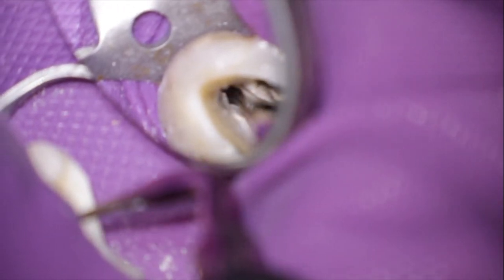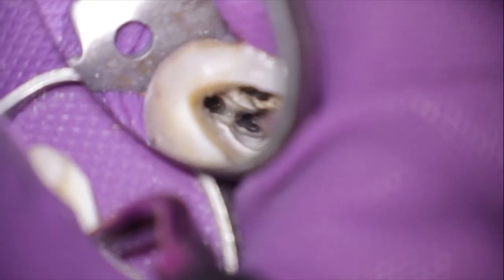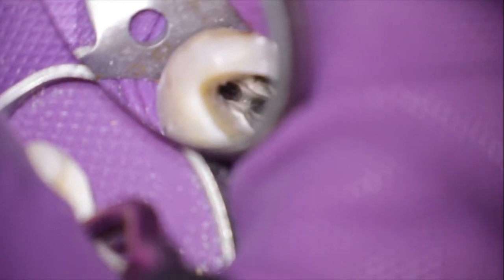Also, I tried a shorter tip, as you can see. This is the purple tip of the Pro Ultra series, but you can see nothing happens. So what is the solution to this problem?